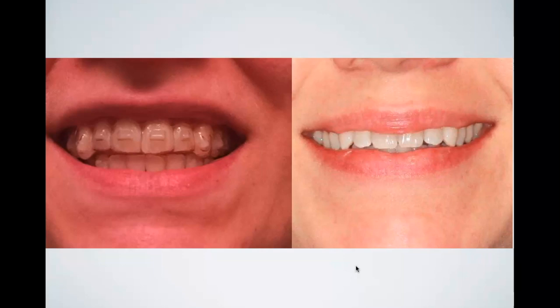But as it puts pressure somewhere on the tooth and the tooth moves, there's also some level of deformation of the aligner itself with any aligner system that you use. And so they talk about using multi-thickness materials and different things like that to make the material more resilient, more like a nitinol wire, to where it bounces back. But in all honesty, there's no thermoform material out there that you can truly restore to 100%. So they make up for those insufficiencies by creating less movement per stage and a number of other ways, like making the aligner thicker so that it has more force up above and less rebound.